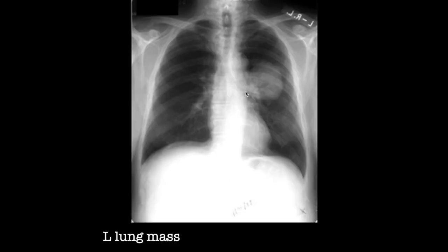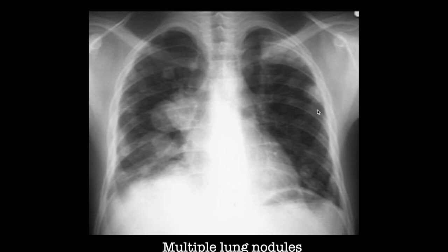Moving on, this is a mass — a large left lung mass centered near the hilum. This is a bronchogenic carcinoma. Here are multiple nodules. These large nodules are called coin and cannonball lesions, and these are typical of renal cell carcinoma, though not exclusively so. If you see them, you should try to exclude renal cell carcinoma as the likely diagnosis. These are metastases.